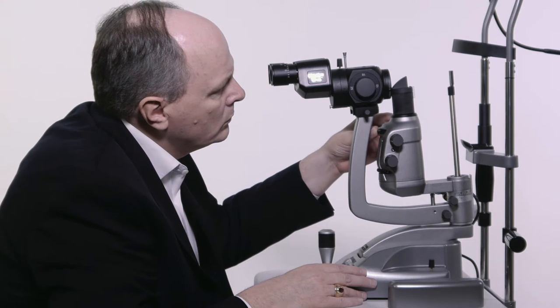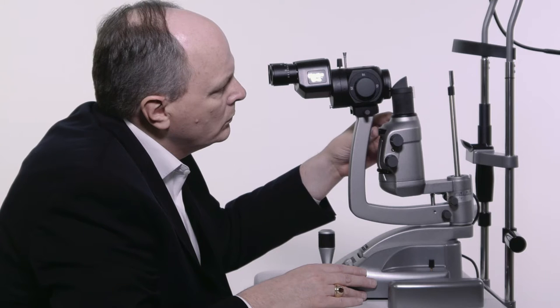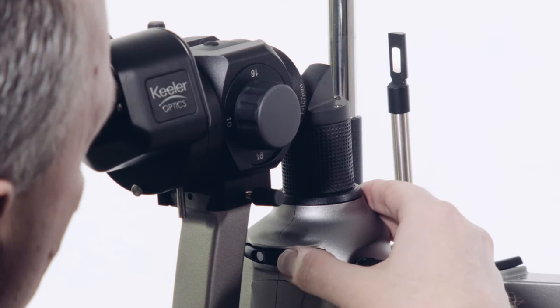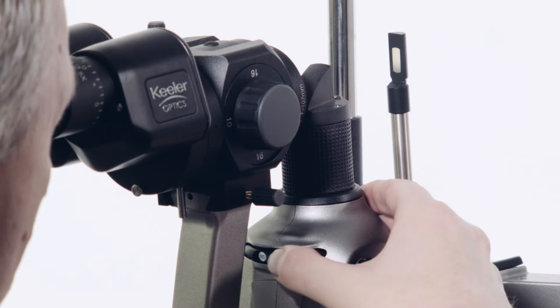The Z-series slit lamp offers a full range of filters required for examination. These filters are blue, clear, red free and neutral density diffuser.